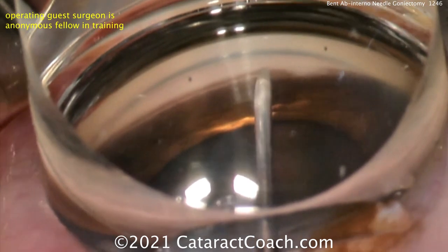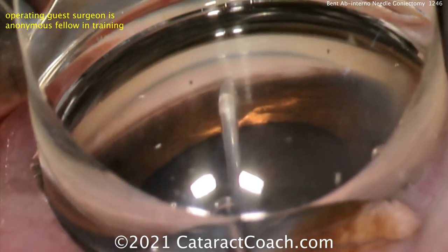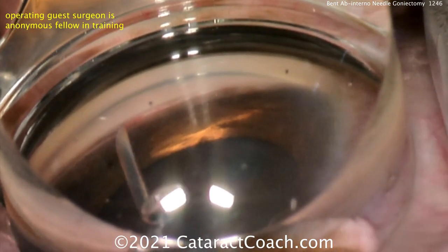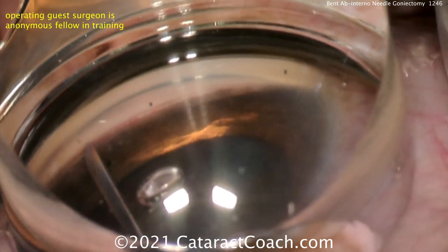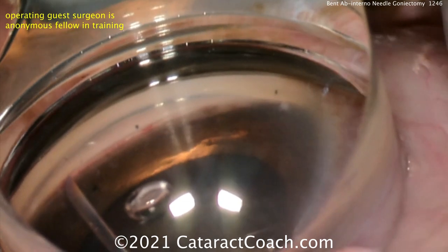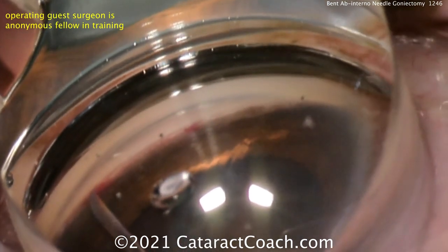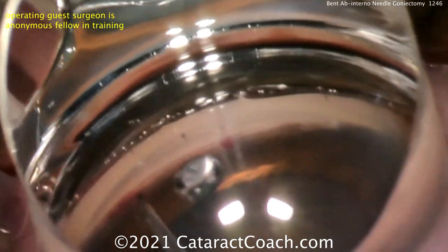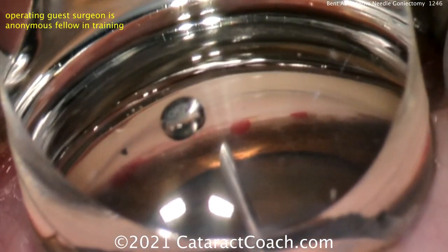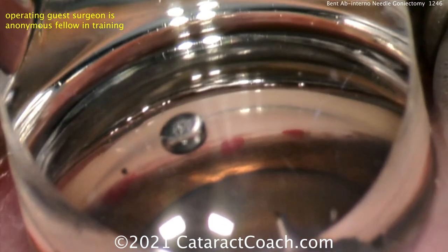Now Arsham's fellow doing the very first attempt at this procedure. Holding the gonio prism appropriately — don't put too much OVD because you'll collapse some of the structures, and also avoid getting blood under the gonio prism. You can see this technique is working beautifully: cutting across in one direction, then going back the other direction, flipping the needle tip to the other side. You'll see some reflux of blood, which is totally normal and expected. This was very efficacious, done by a fellow on their very first attempt. The first video shown was Arsham himself on his very first attempt at the BANG procedure. Congratulations to Dr. Shabani for a beautiful technique that will help countless patients across the world.